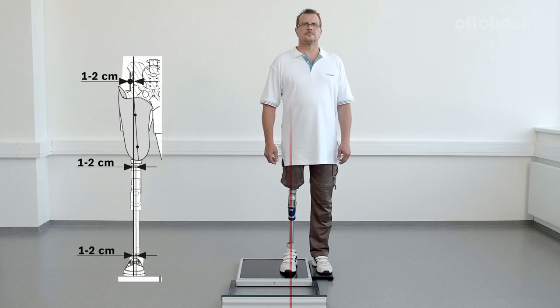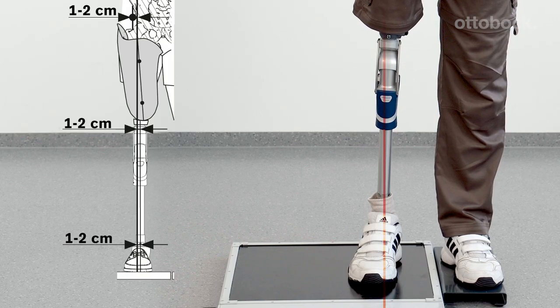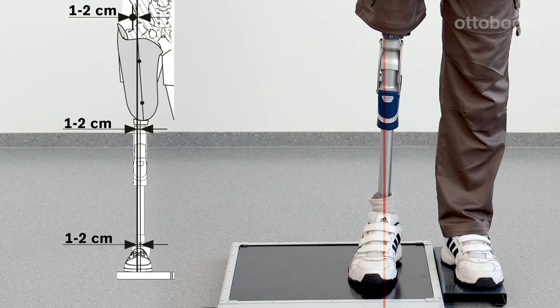Looking at the frontal view of the knee, the alignment reference line runs through the middle of the prosthetic foot, middle to outer edge of the knee, and middle of the socket.